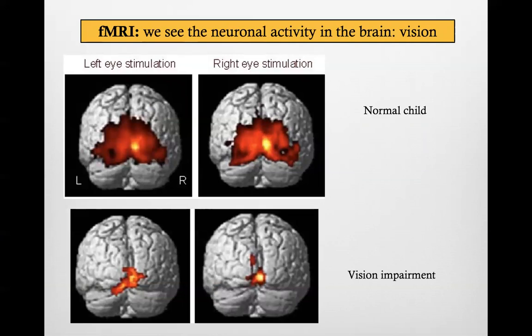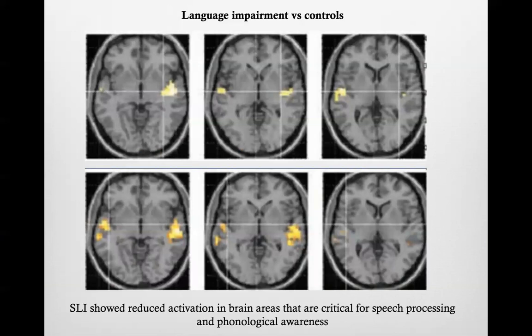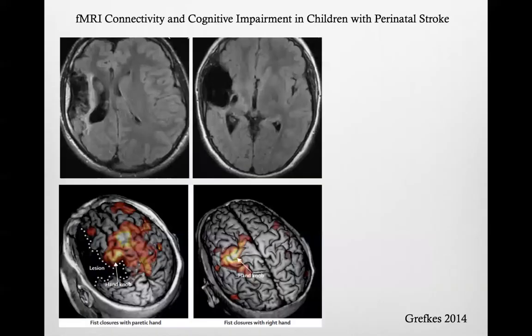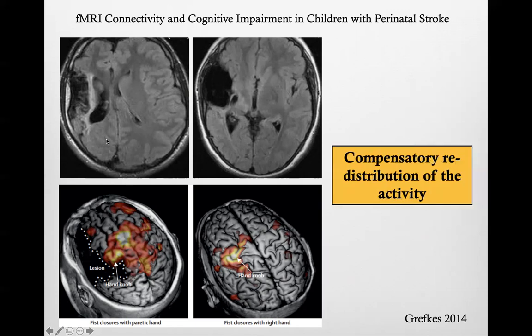In a child with a vision problem, there is a massive reduction of activity in the visual areas. Similarly, there can be reduced activation in brain areas critical for speech processing and phonological awareness when there is a language impairment — you can see the normal versus pathological activation of language and auditory areas. This is a child with a middle cerebral artery infarction, an ischemia. They showed how motor function moved, thanks to neuronal plasticity, more laterally, because the area that normally controlled the hand was damaged by the ischemia — a compensatory redistribution of activity.